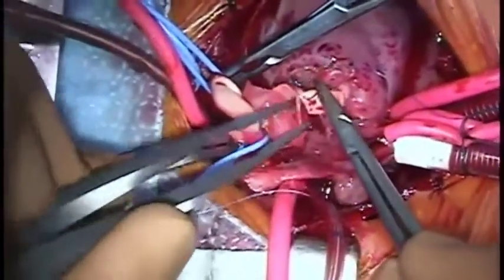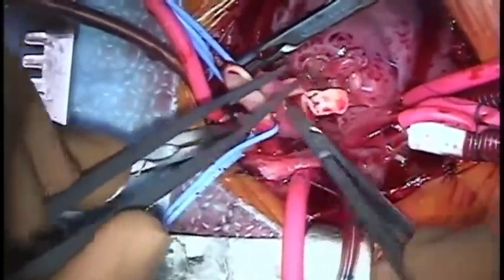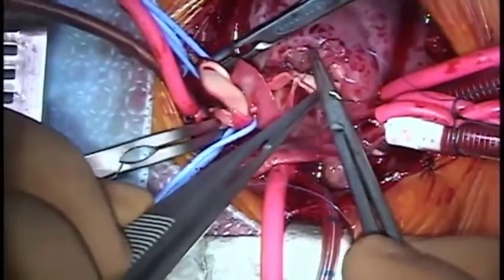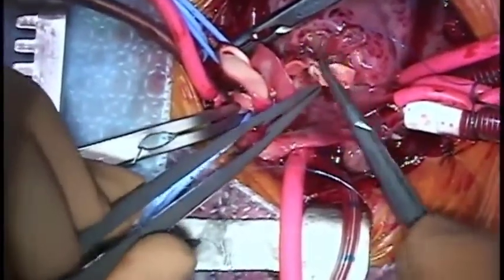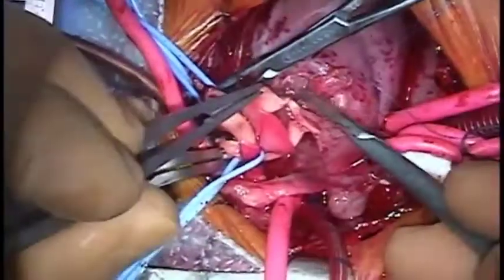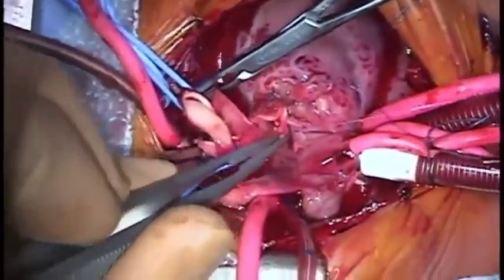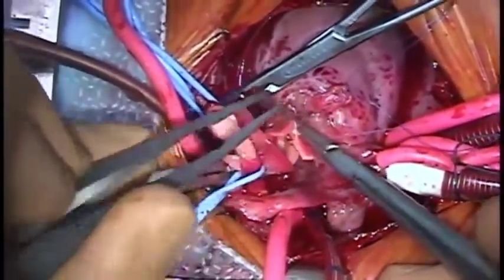Again, care must be taken when positioning the first suture to ensure that the coronary artery is not rotated. Because the aortic incision is essentially symmetrical, the sinus is fashioned by spacing suture bites further apart on the coronary than on the aorta, on both sides of the button. Creation of a sinus is important to reduce tension on the coronary ostium.